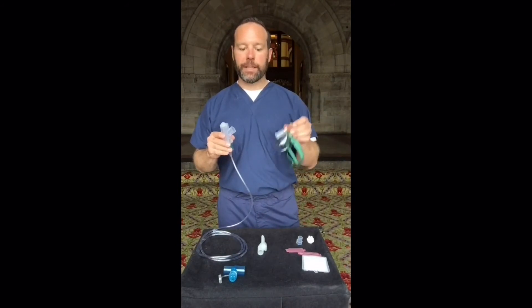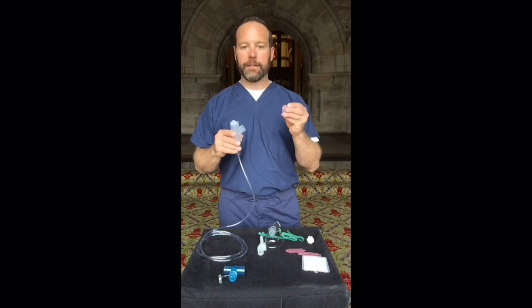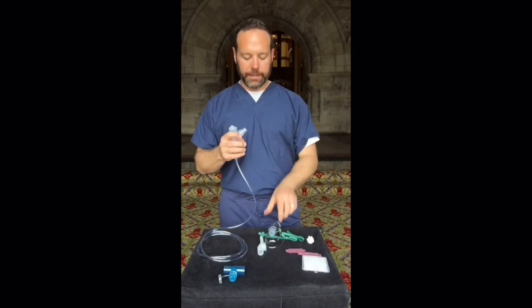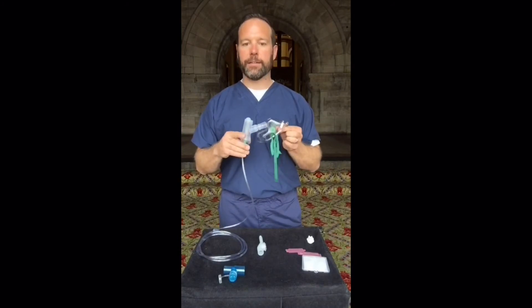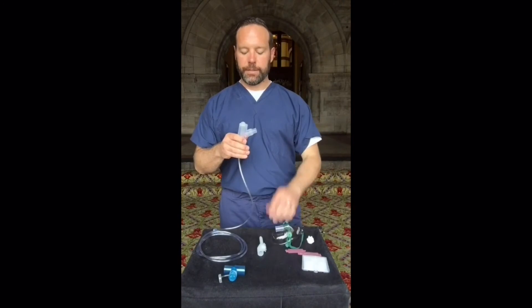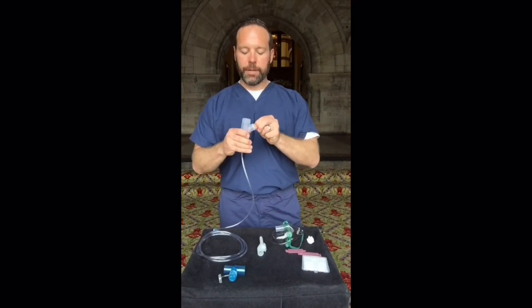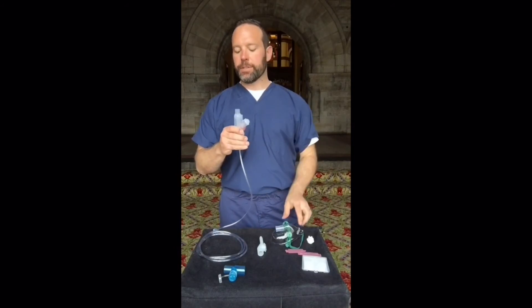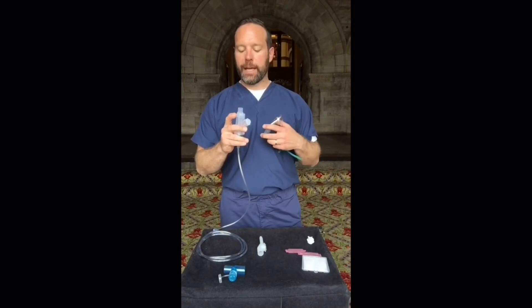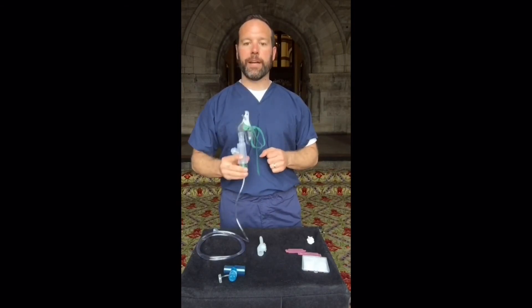If the aerosol mask that you have does not fit snugly into the Nebutek, there is a male-to-female adapter that may be placed into the Nebutek and then a mask directly onto that. If the patient needs the Nebutek to have the mask in the top position, replace the valve back into the side, put your mask adapter into the top, and then place the mask directly onto the top of the device.